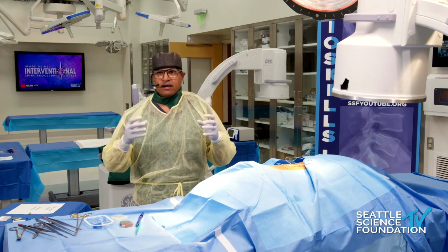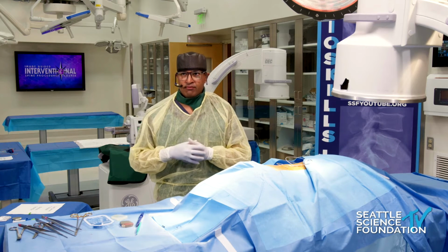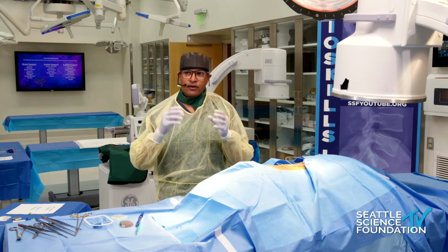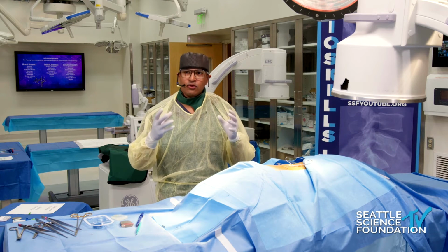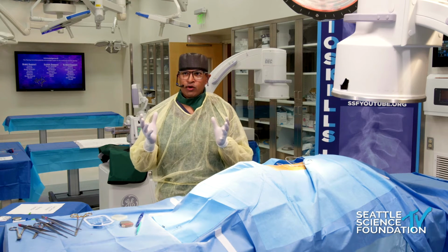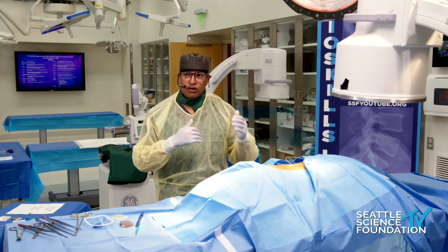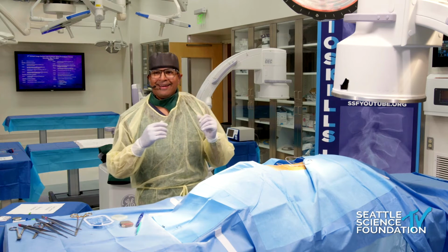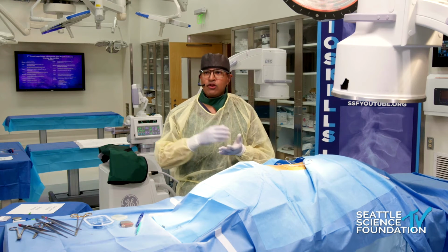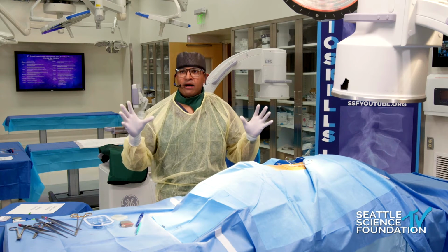Number one, the concept of remote therapeutic monitoring is really important. As you've already heard, it's used in other areas of medicine, cardiology being a primary user, but there are many others as well, neurosurgery, et cetera. And what's really important is there is a code for this, which you can bill for, but you've got to use it the right way. We cannot abuse this code. So every month, we need to track our data, look at the summary report, understand what's going on, talk to the patient, whether that's in person or audiovisual right now during the times we can, and then document exactly what we're saying, how we're going to alter the therapy, if at all, and then you can submit for reimbursement for that particular code. We need to all be very careful about how we do that.